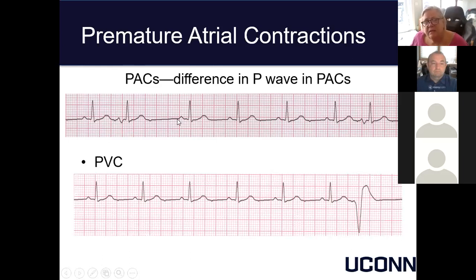It's not the same as these other more normal ones. So again, do your rate calculations, look at your P waves, note the difference for these contractions.